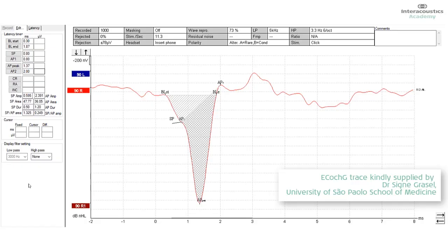For the area, that's defined as the point where BL start and BL end, and the area under that is the SP area, and the AP area is defined by where AP 1 is marked to AP 2. That's the AP area.